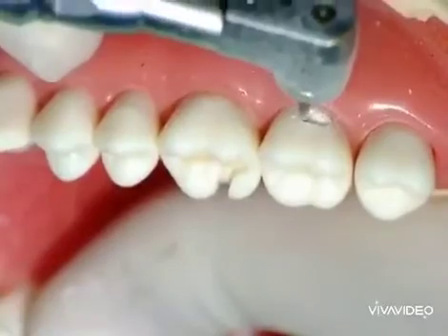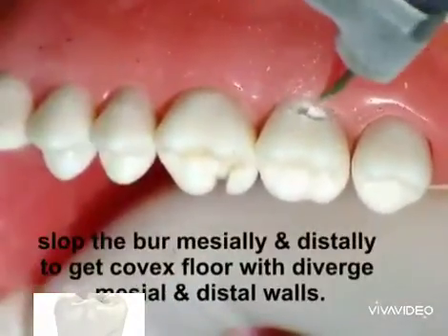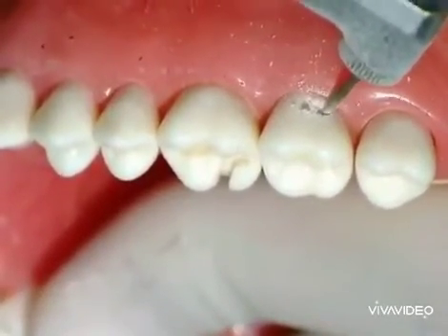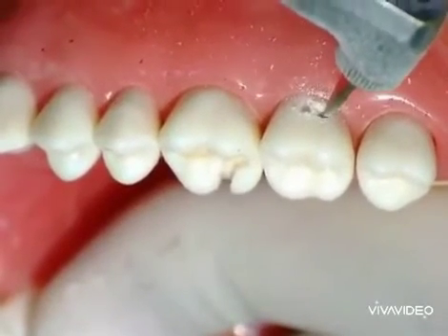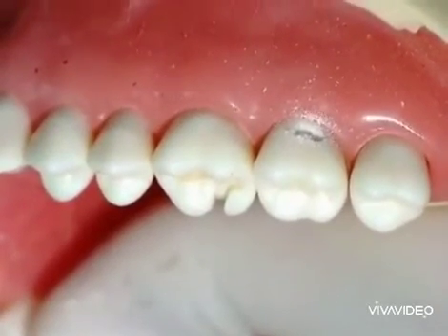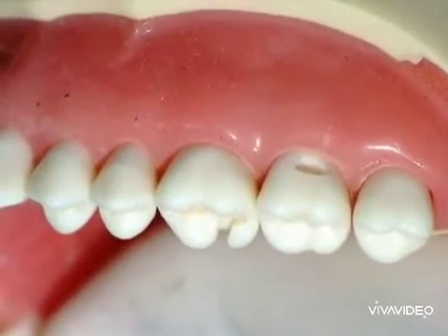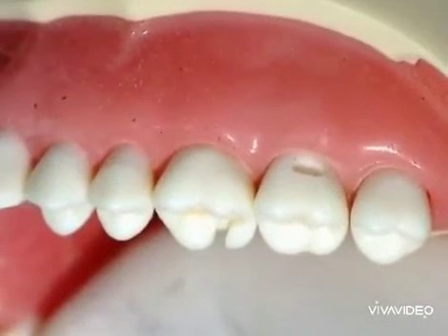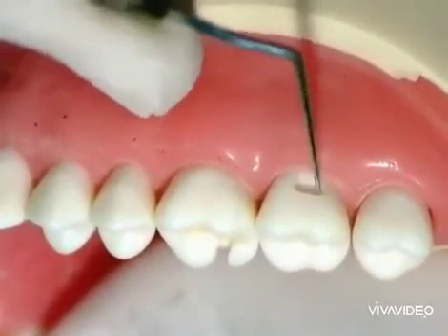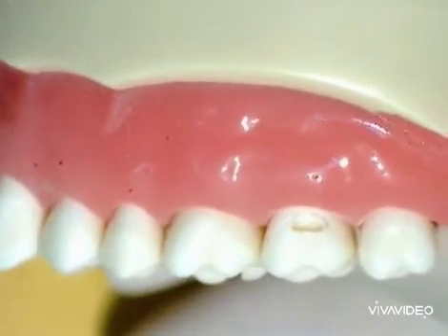Minimum depth is required to provide retention and uniform bulk of amalgam for strength of the material. We slope the fissure bur mesially and distally in order to create mesial and distal walls that are slightly diverged to the outside. The axial wall should be slightly convex, following the convexity of the buccal surface of the tooth.